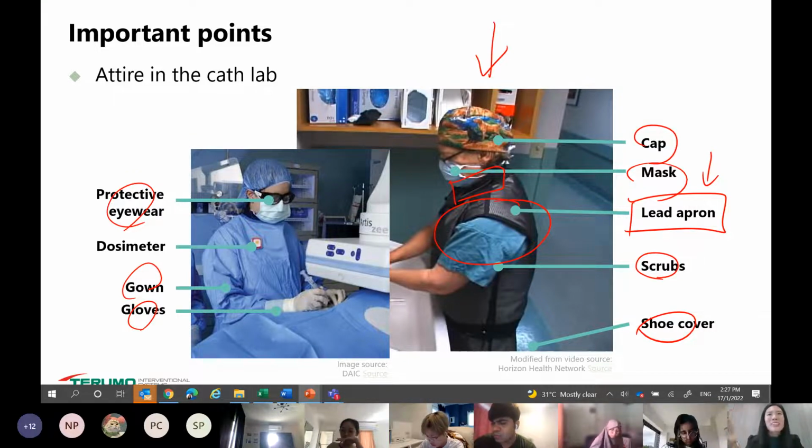One thing to note is that for the first operator and second operator, we typically don't pass them anything. Like, you have devices in boxes. We typically don't pass them at all. You have to take note of this when you're in a cath lab. Do not touch them. Their attire is for sterility and everything. So you need to not touch them. Let the scrub nurse or second operator handle everything. When you throw devices later, I will let you know.